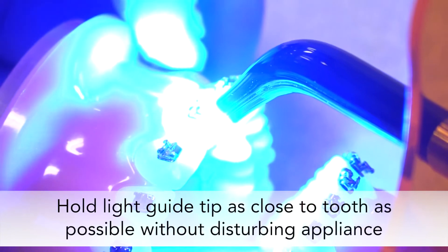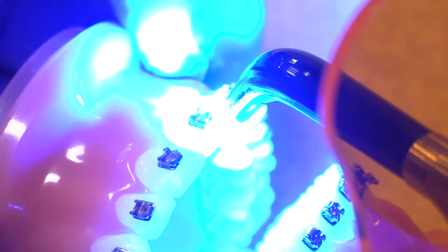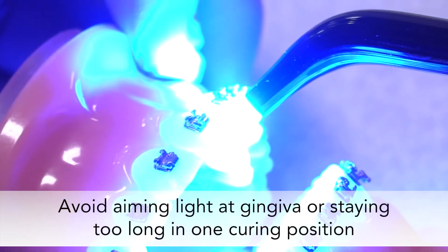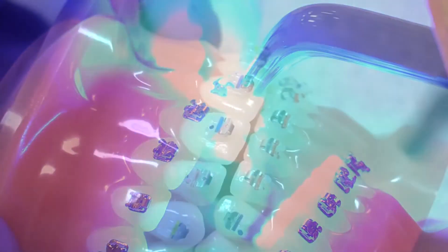During bonding, hold the light guide tip as close to the tooth as possible without disturbing the appliance. One of the normal side effects of such a powerful light is increased heat at the tip of the light guide. While curing, avoid aiming the light at the gingiva or staying too long in one curing position. When the light is used properly, you should get all the benefits of fast, reliable curing without heat-related issues.